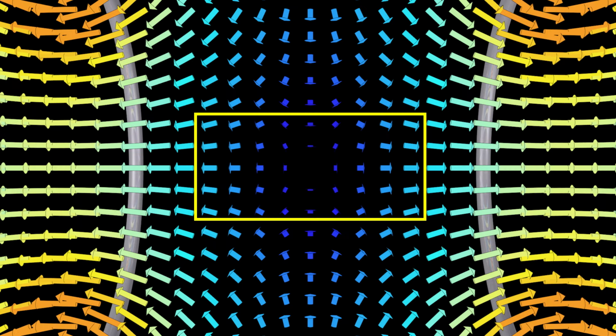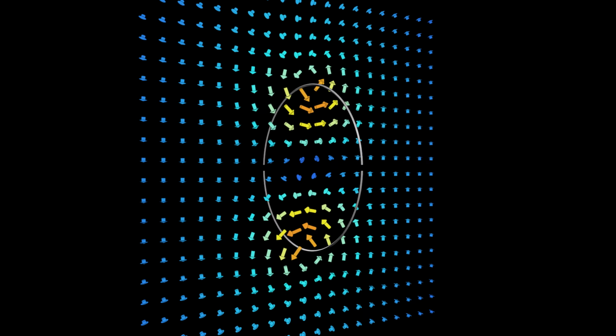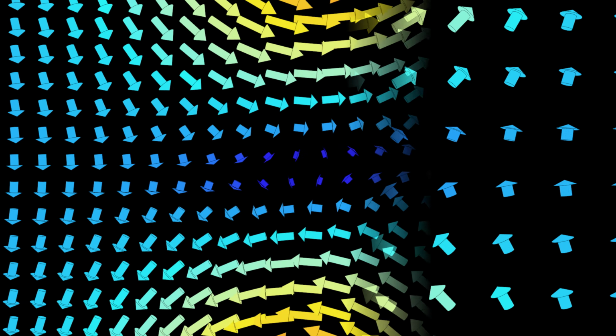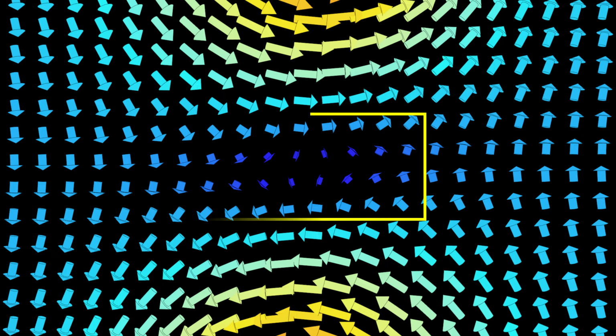For the X and Y gradients, imagine that I could take the same wire loop but cut it in half horizontally. Then I'll send current in these directions for the top and bottom halves respectively, and that current flow will create this magnetic field. Check it out, right in the middle is a linearly varying field in Y. Field increased in the Z direction at the positive Y and decreased at the negative Y. Again, it's not perfect here due to the simplicity of the 2 half-loop design I'm modeling, but real-life gradients build off this design known as a saddle coil or Golay coil design.